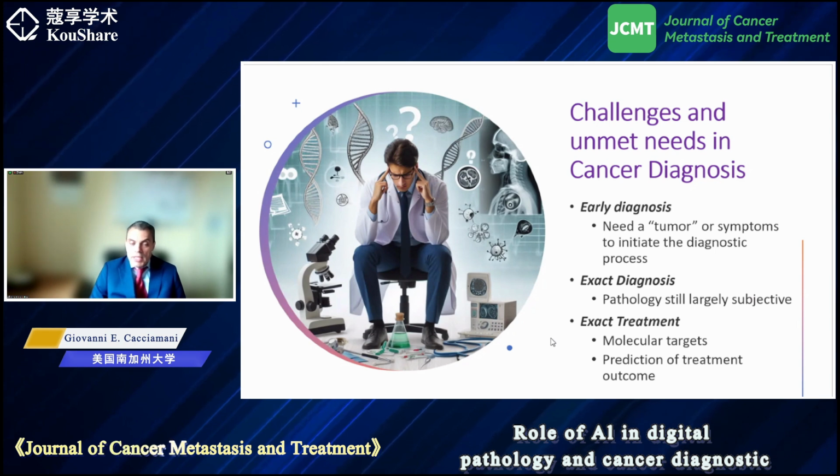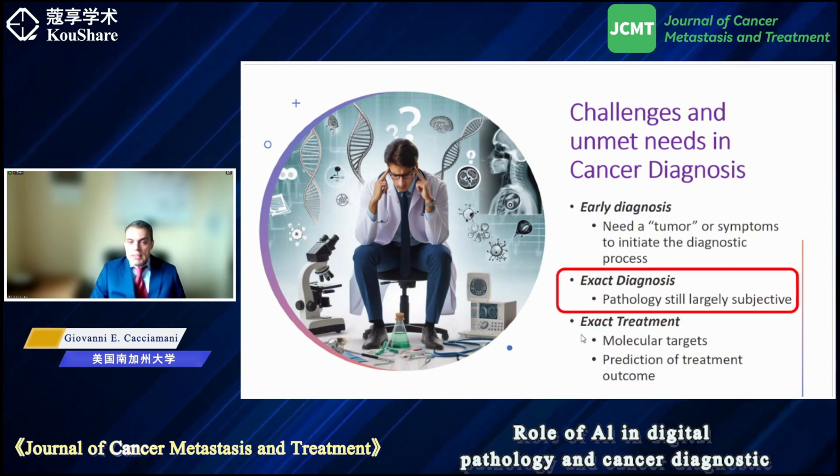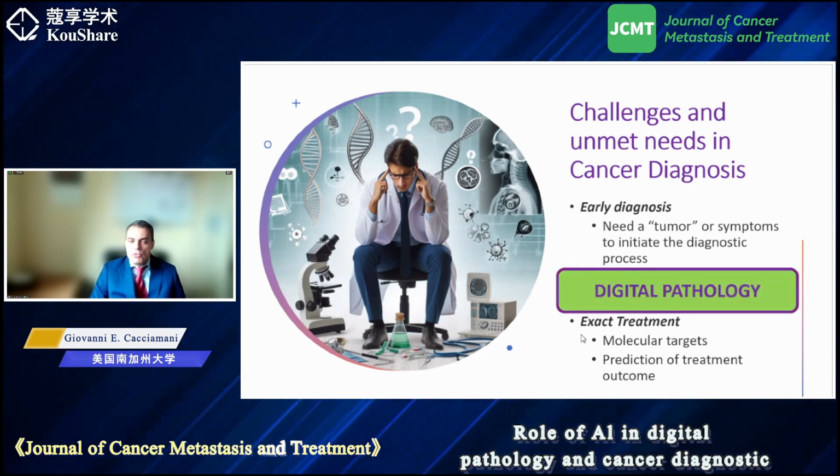And particularly, even when the diagnosis is good, maybe we still lack molecular targets that can predict the best treatment and the most likely outcome for patients. And in this regard, at least for what exact diagnosis, objective diagnosis is concerned, digital pathology may certainly play a role.